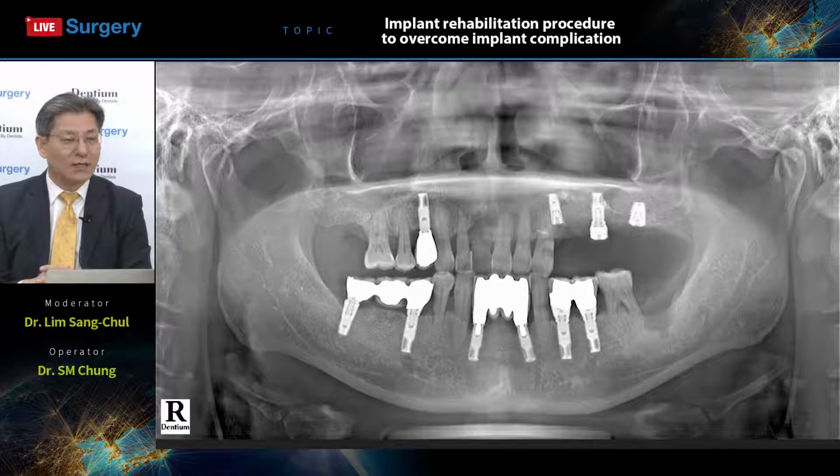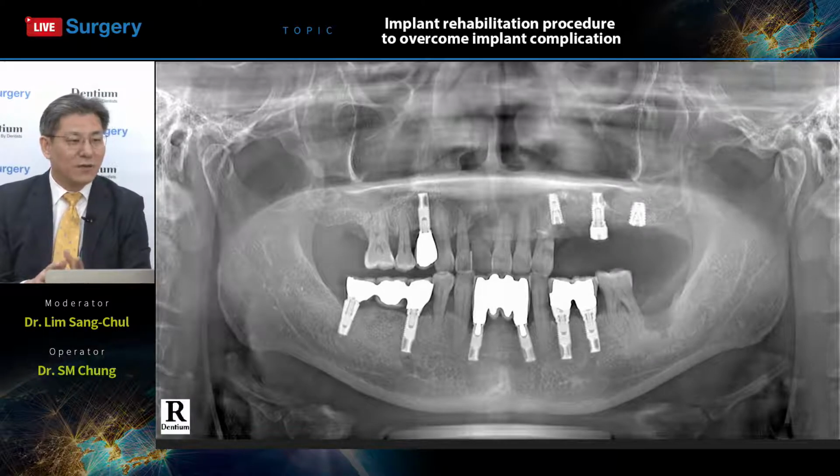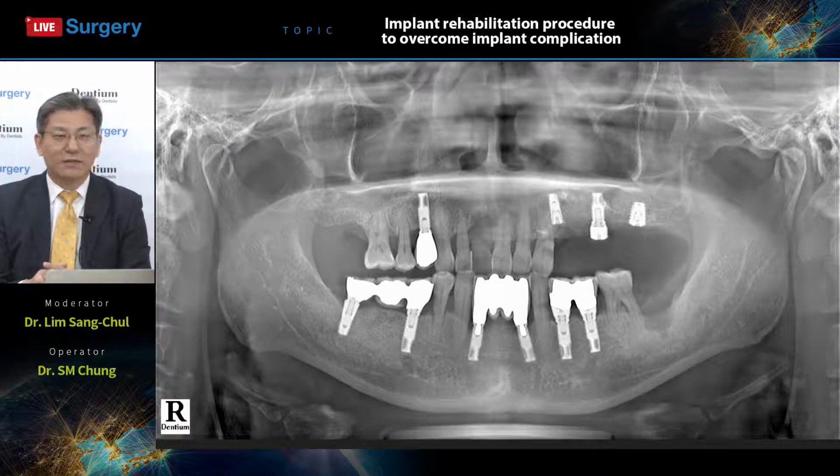When he decided on deep insertion with the bone level implant, he used a high-speed bur. When we use a high-speed bur, we have to pay attention to emphysema, right? Anyway, today's surgery was successfully done, even with the very big, bomb-crater-like defect near the neighbor area.